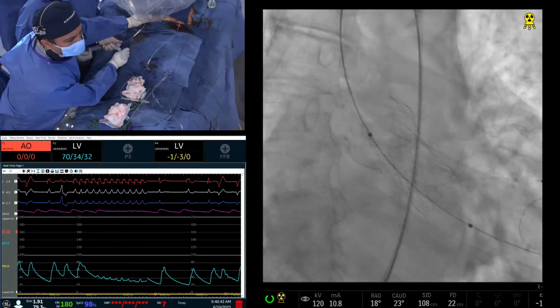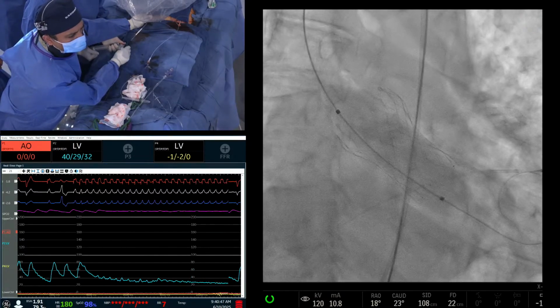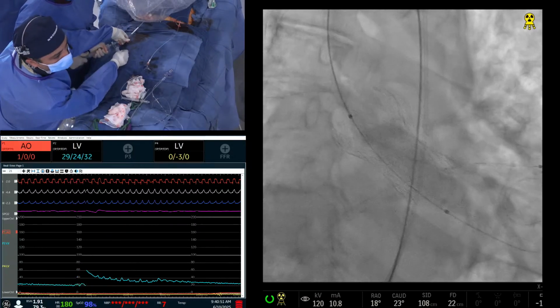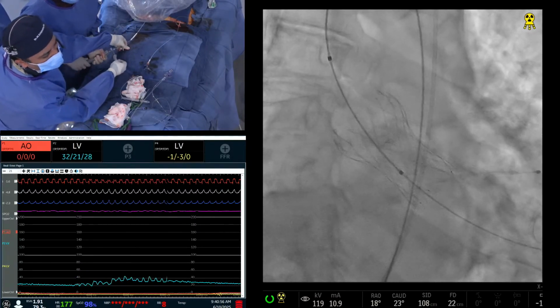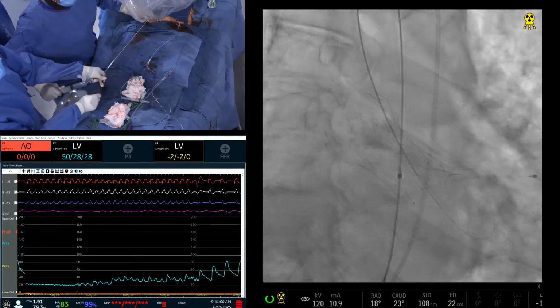Okay. Yeah, good. It's coming up. Good. Okay. Off. Off. Okay. Echo. Okay, come back. Wire out.